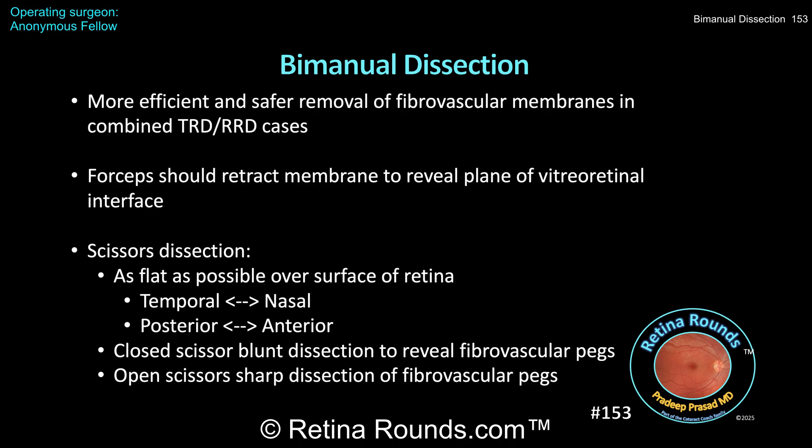Here are some take-home points. Bimanual dissection can be a more efficient and safer surgical approach when dissecting fibrovascular membranes off of detached retina. With respect to the forceps, it's important that they reveal the appropriate surgical plane right at the vitreo-retinal interface to make the dissection easier. Ideally, the forceps should retract and reflect back the membrane to reveal this plane, pulling away from the scissors. The degree of traction should be at a moderate level to facilitate dissection, but not so much that an iatrogenic retinal break is created.